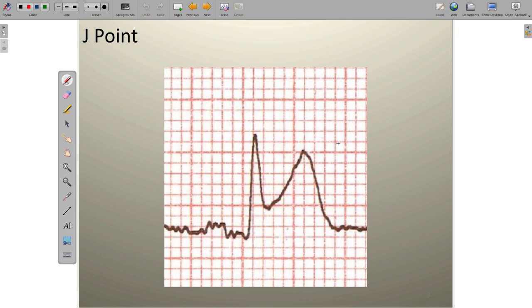The first thing we want to do is identify and recognize exactly where the J point is. The J point signifies the end of ventricular depolarization and the beginning of ventricular repolarization. Another way to look at it is that the J point is where there's a departure from the QRS complex into the ST segment and T wave. There's usually an acute angle at this departure point, and in this case the J point is located right here in this tracing.